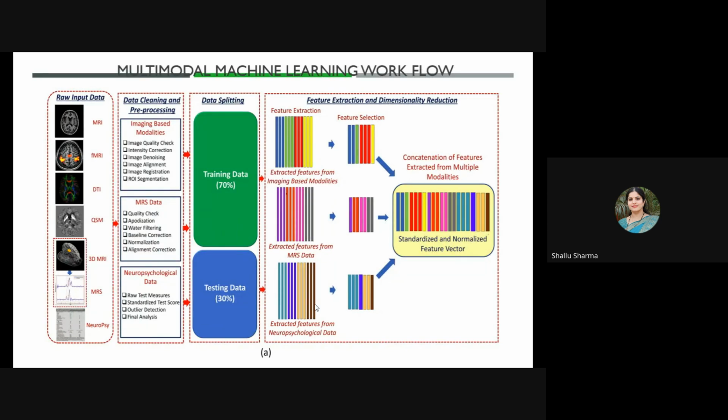The next one is image alignment, because whenever we perform MRI scans, due to the movement of the subject, the subject can move her or his head within the MRI cabin. In that case, what will happen? We have some misaligned images. So in that case, we align those images by using some brain template. There are various well-known brain templates used to align the image.